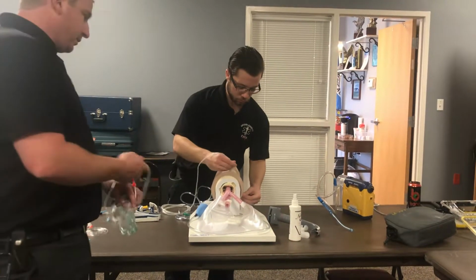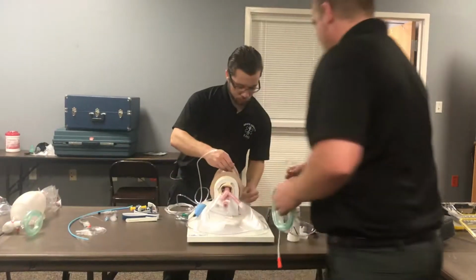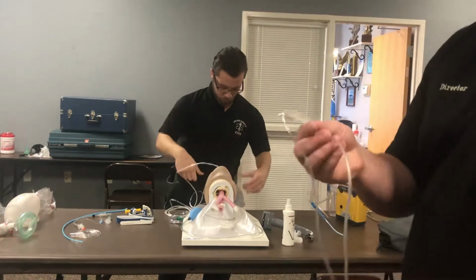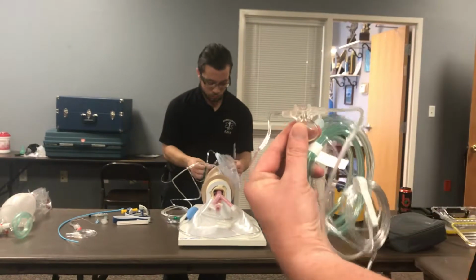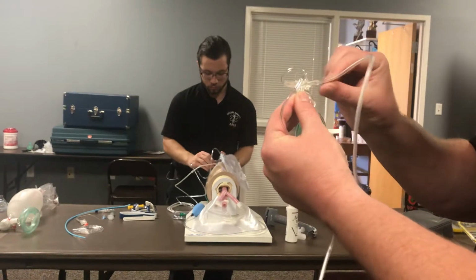And if you're wondering, if we're putting a nasal cannula on, why aren't we using an end tidal? We know this is showing up. The reason being is on an end tidal, these nasal prongs don't actually provide any oxygen.